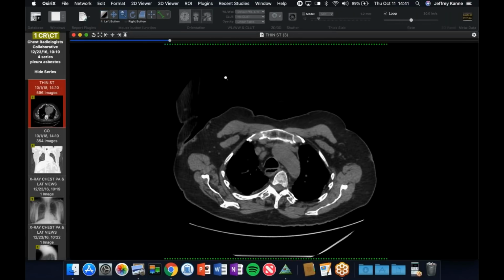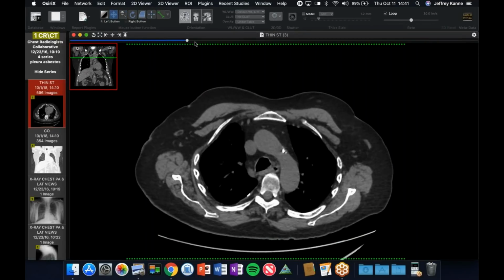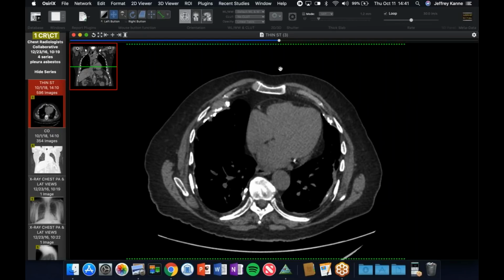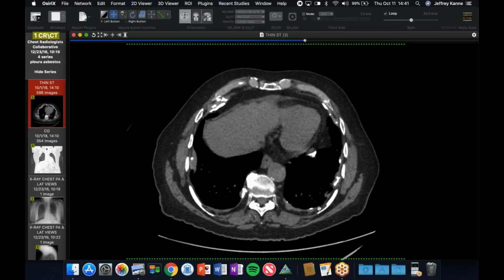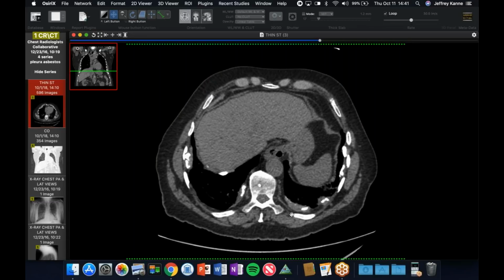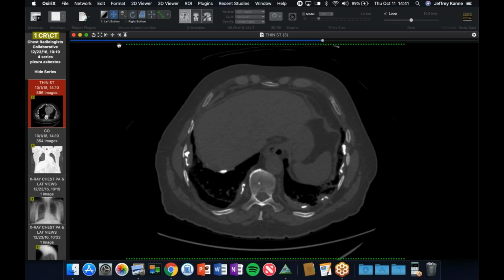I know David isn't here, but he gave a nice description of it, and I'll try to rehash what he said. These exuberant pleural plaques, and you can see them on both sides, but along with the plaque, I would argue you're probably getting into the realm of diffuse pleural thickening. These are nice plaques, sort of looks like the mesas lifted up, but then you've got this denser band. And you'll notice some of the hyaline or plaque tissue sort of pushes itself into the extrapleural fat quite a bit.